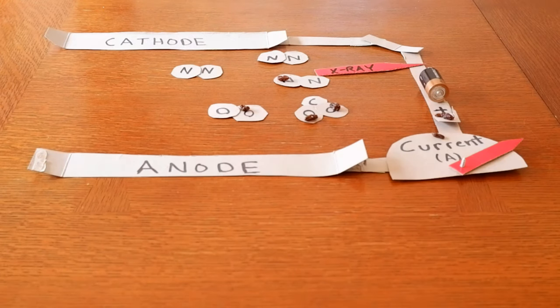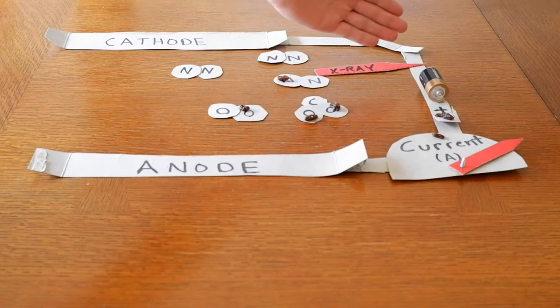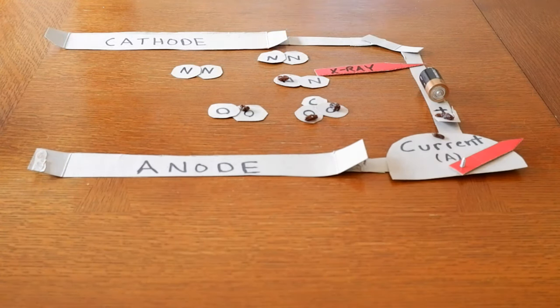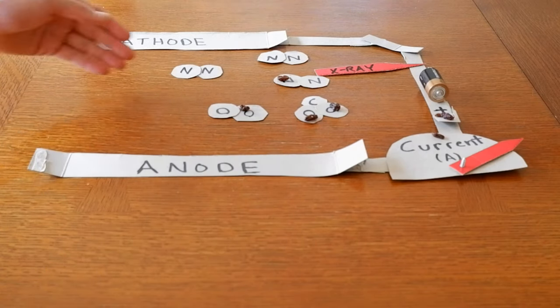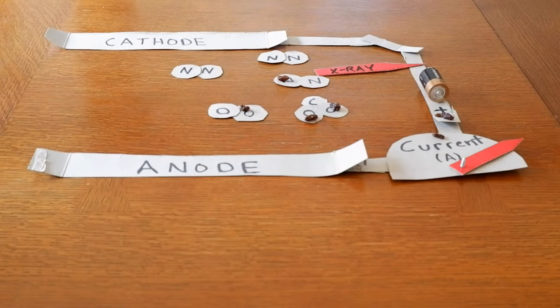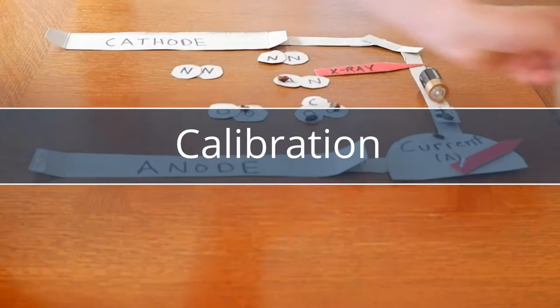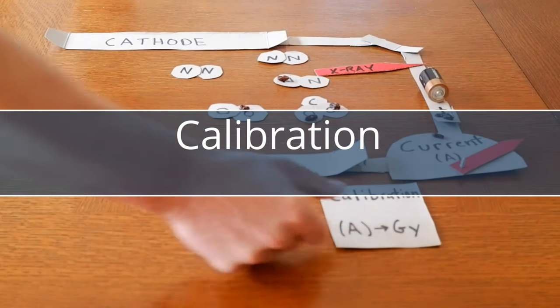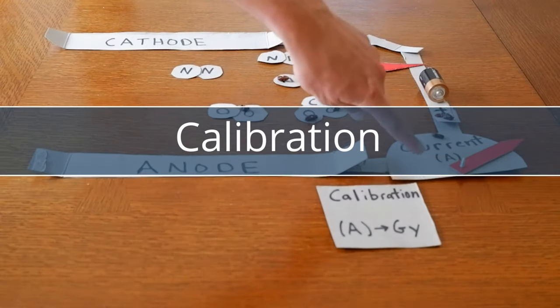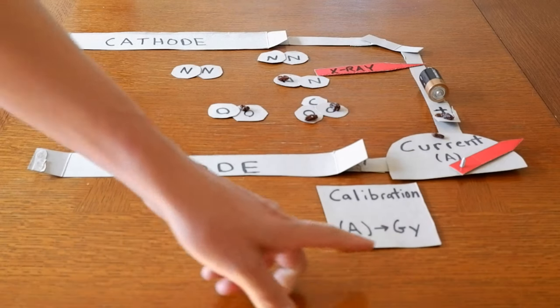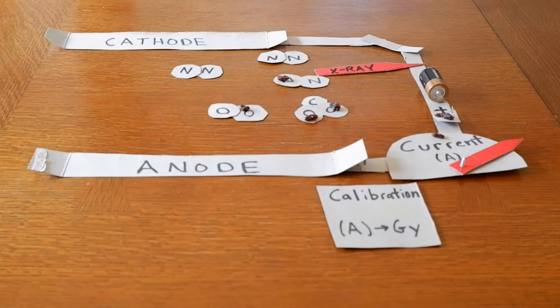And that is related to the radiation dose, which would actually be occurring due to these x-rays. A calibration factor is used to go from the current, which is measured in amperes, to for instance in CT dosimetry, to a value in gray.